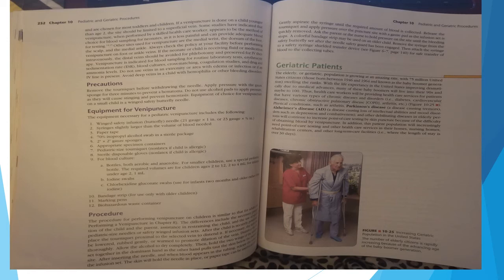Do not use veins in an extremity or area that has edema or infection, or if an IV line is present. Avoid deep veins in a child with hemophilia or other bleeding disorders. Precautions. Remove the tourniquet before withdrawing the needle. Apply pressure to the gauze sponge for 3 minutes to prevent hematoma. Do not use alcohol pads to apply pressure, as they will cause stinging and prevent hemostasis. Equipment of choice for venipuncture on a small child is a winged safety butterfly needle.